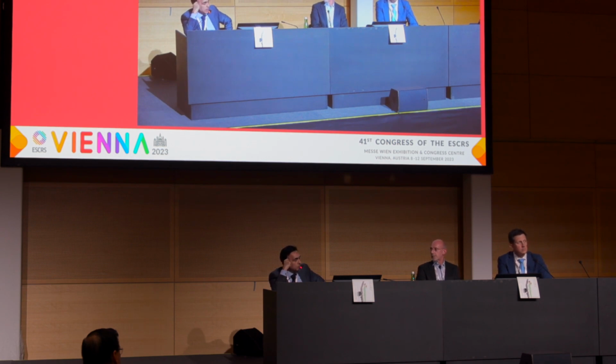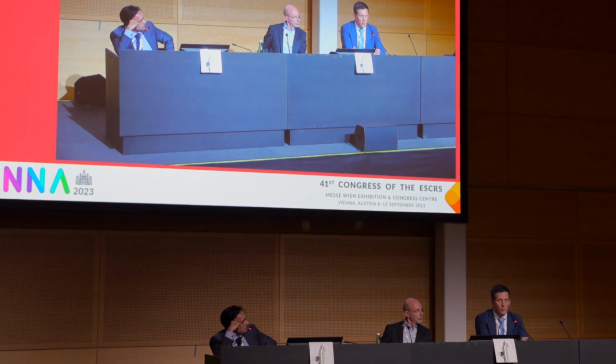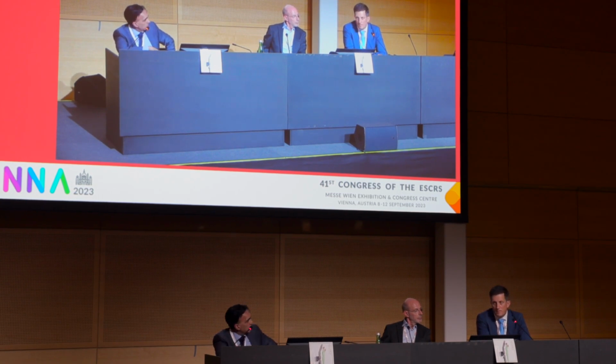And so if you flip the question then, for people who may be starting to use this technology, Stefan, you showed a basic comparison to monofocal. Is there any downside of basically just using this lens? I know there are slightly more symptoms that you showed in the subjective questionnaire, but you explained they were quite mild. Is there any downside from using this in replacement of a standard monofocal? What we found in our study, there might be a slight chance for having halos as compared to other designs.